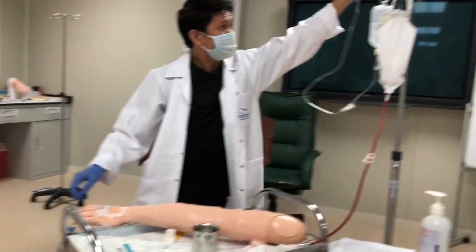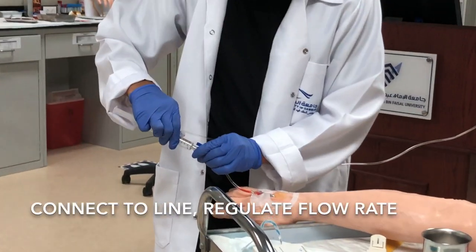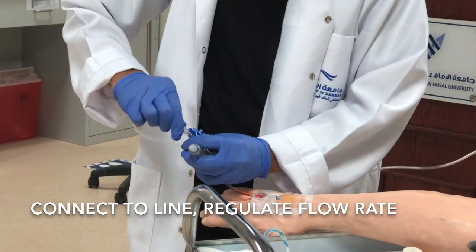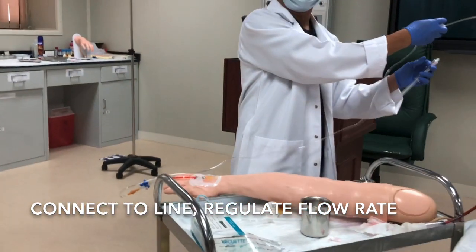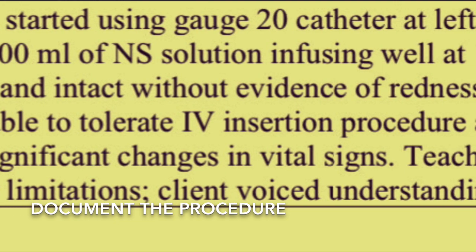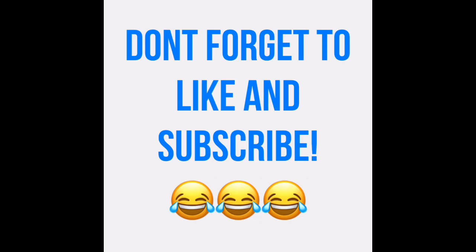You can now connect it with the IV line and start the infusion according to the calculated flow rate.